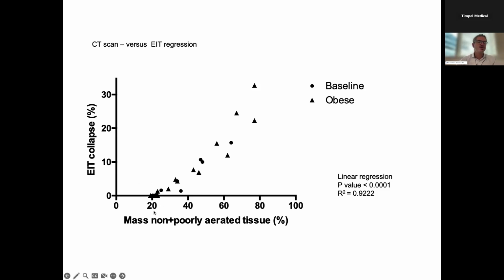And you don't want to expose your patient to these high pressures because you're worried that it might have hemodynamic consequences or barotrauma or whatever. So it means that you don't really have to know that the patient has 20%, because you're not willing to expose the patients to PEEP levels that will prevent this collapse from appearing. So it's a kind of navigation map among the PEEP choices that you're willing to apply to your patient.